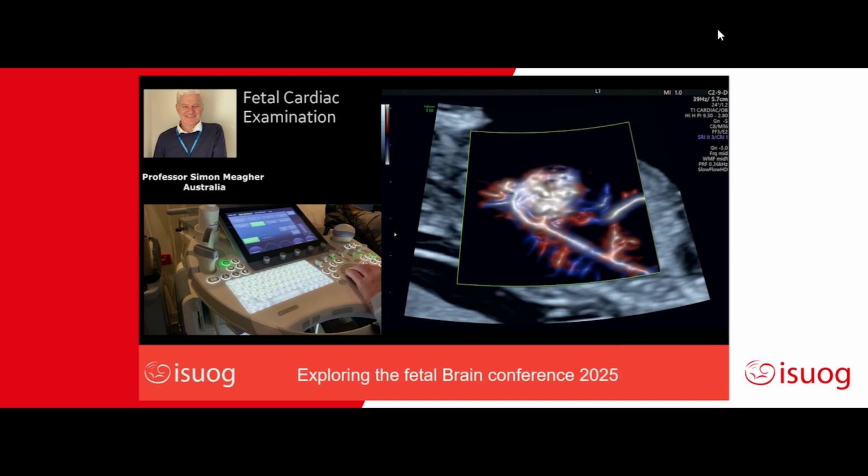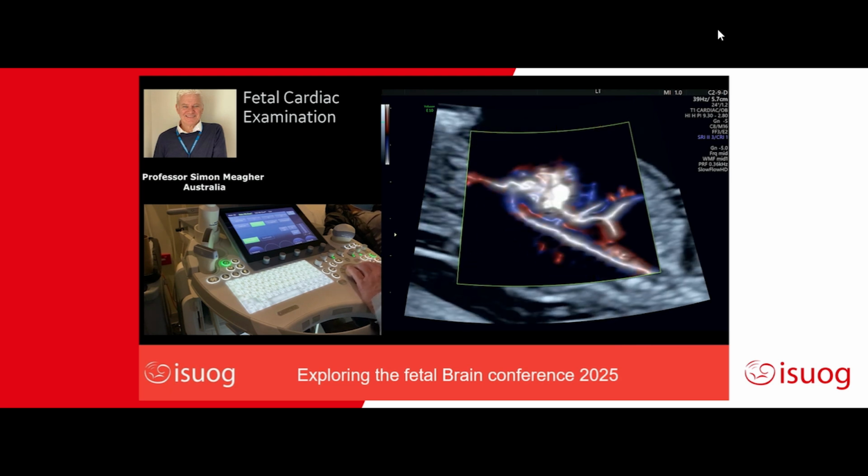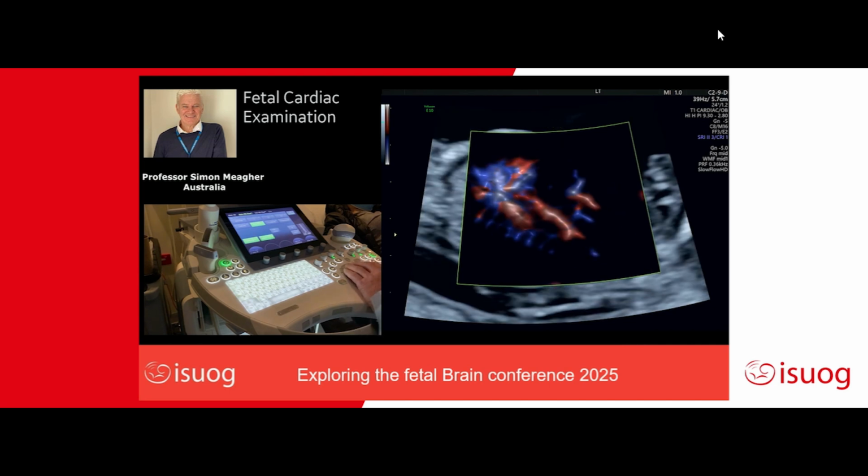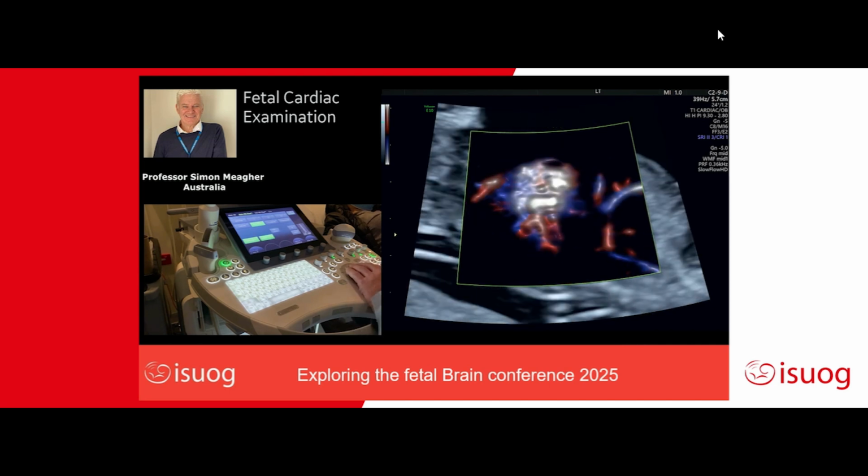Not only are you seeing your aortic arch, you're seeing the innominate, the left common carotid and the left subclavian artery, the three branches coming off the aortic arch. You're also seeing the nice curvature. And then, as I say, you go to the right of that, and then you see your azygos vein coming up and draining normally into the superior vena cava. So that shows you the power of this technology.